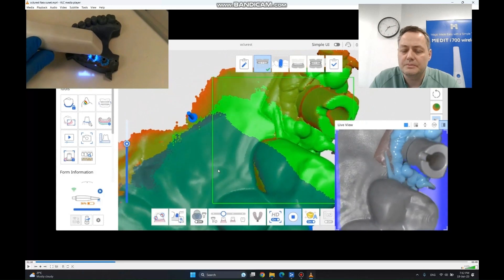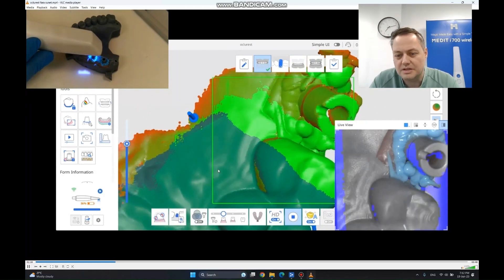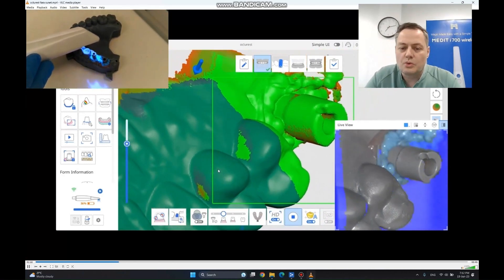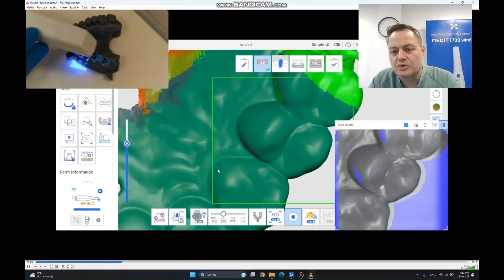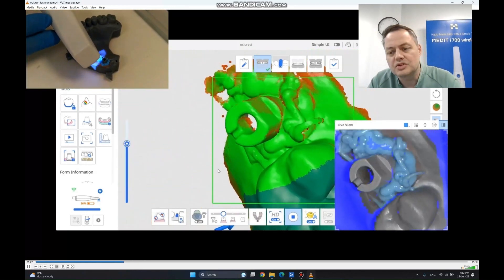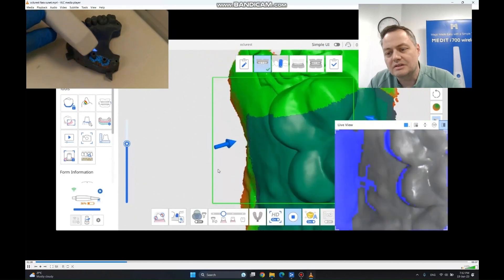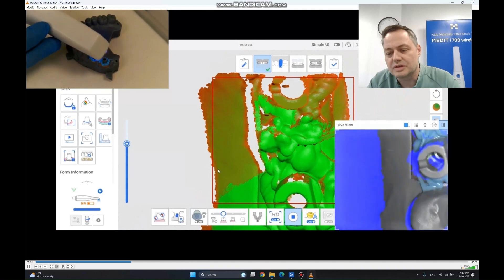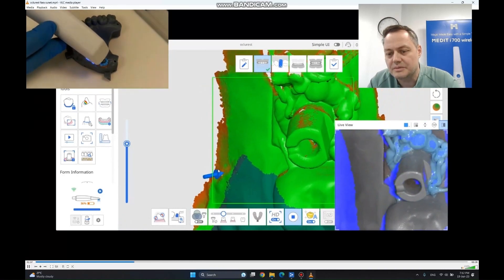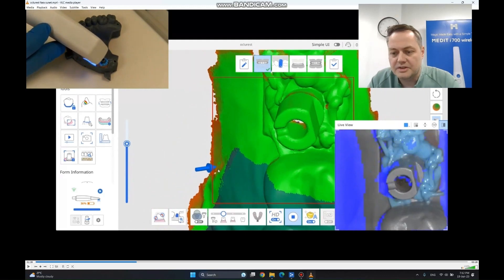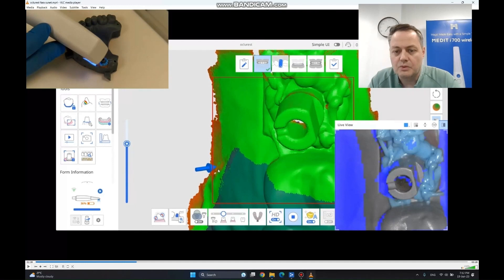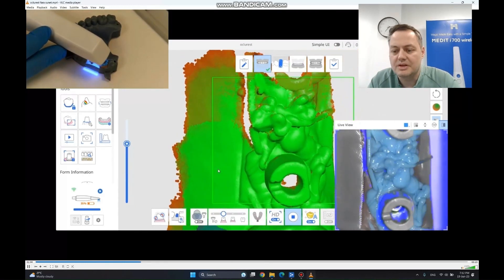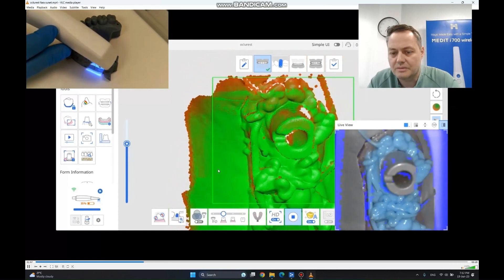You will see how I'm trying to just get the first scan body from any angle and staying in contact with the premolars. I'm not going forward this time, I'm just adding data, but also keeping contact with the teeth and the gingiva as you can see right now. And at this point, I already got the full surface of the first scan body with very good precision, it's completely green, and now I can go forward and get the second one.